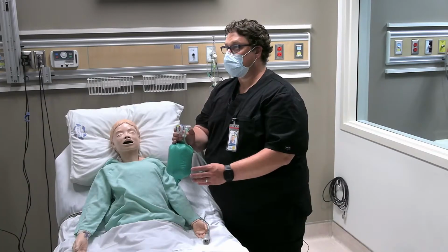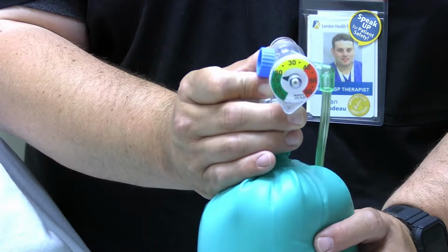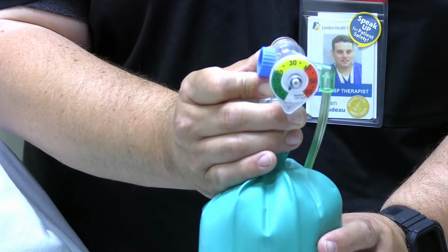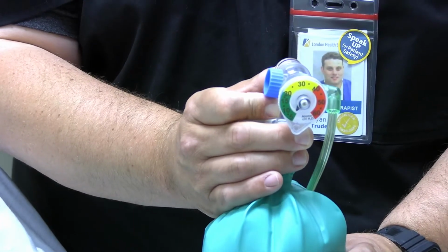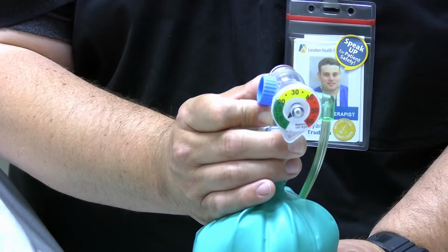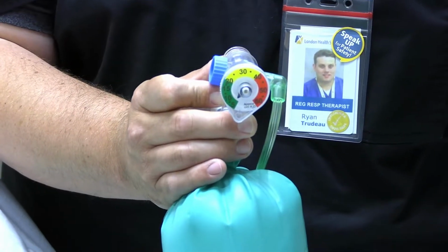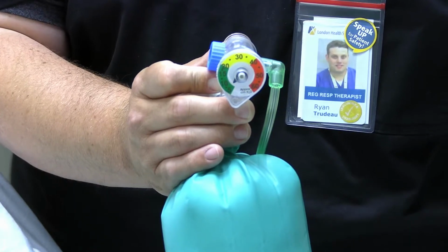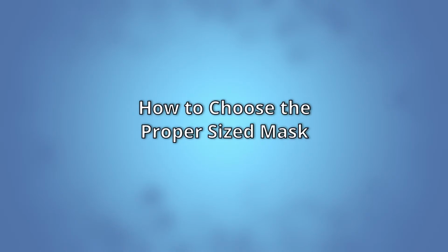Okay, and then my next thing to do to test is just give the bag a squeeze. So the green zone is the safe pressure zone. Okay, if you need to get a little bit more pressure, that's in the yellow. You just squeeze a little bit harder. And if you have to go high in the red zone, you've got to really squeeze the bag in order to do that. Okay, so that's your test to ensure that your flow inflating bag is working correctly.